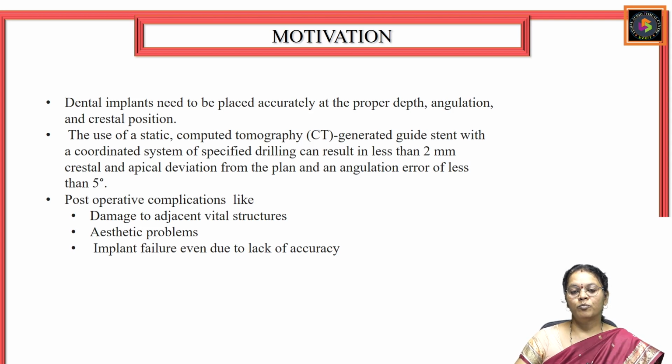Another important aspect of this dynamic dental navigation is that it will handle the post-operative complications such as damage to the adjacent vital structures during the implantation surgery, and it will also provide the feasibility to eliminate the aesthetic problems which subjects usually don't like to have. And implant failure, even due to lack of accuracy, can also be minimized by using this methodology.